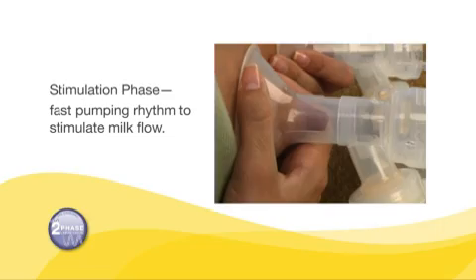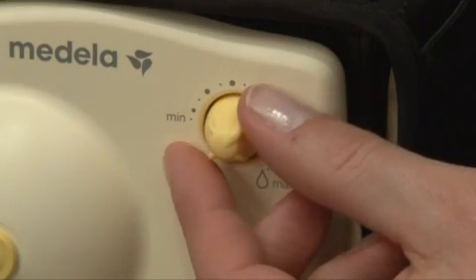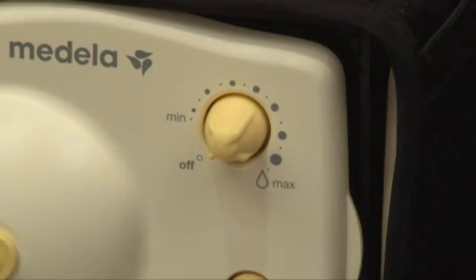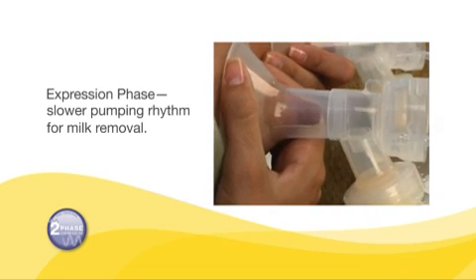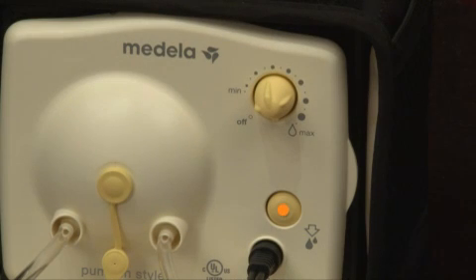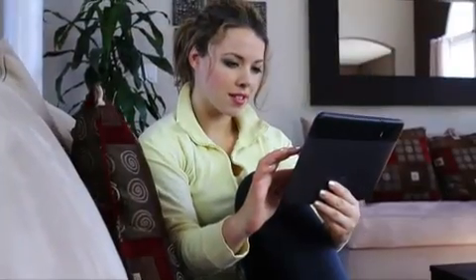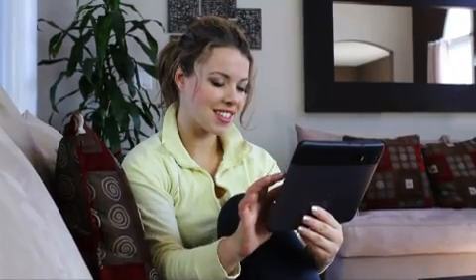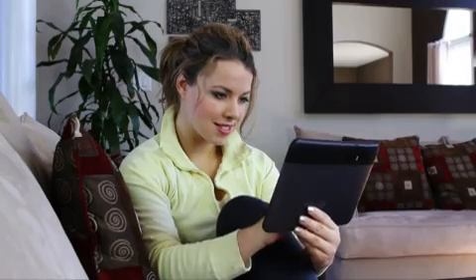Adjust the speed and vacuum to your comfort level while pumping by turning the dial to a speed that is most comfortable for you. After 2 minutes, the stimulation phase will automatically change to the expression phase. If you let down, this is when your milk starts to flow. Sooner than 2 minutes, you may pump more efficiently by pressing the let down button at that time to switch to the expression phase. If letdown does not happen after 2 consecutive stimulation phases, take a break, relax, and try again in 15 to 30 minutes.